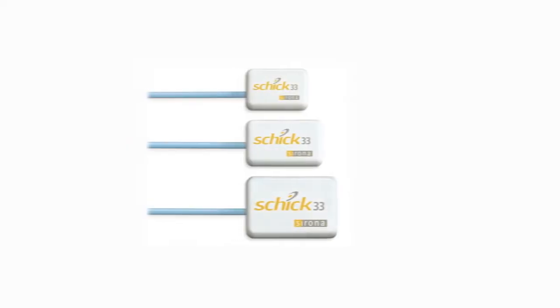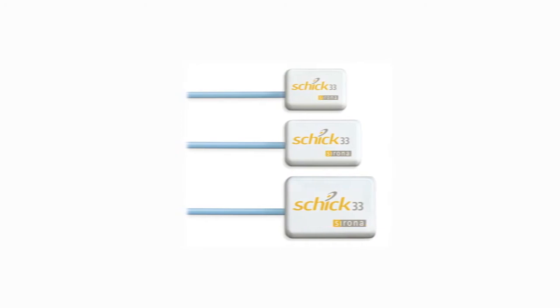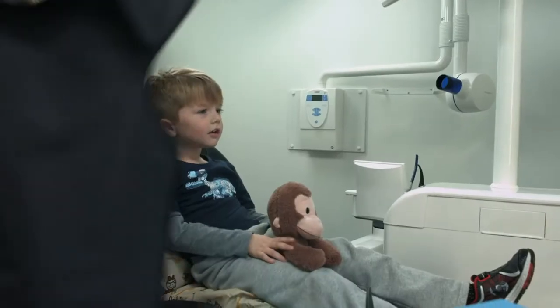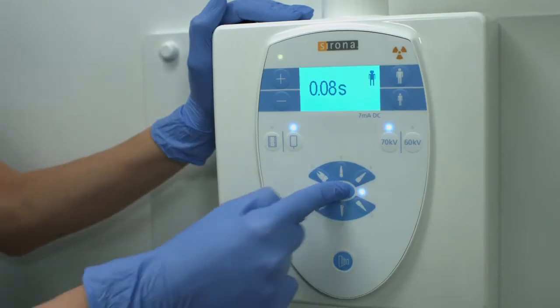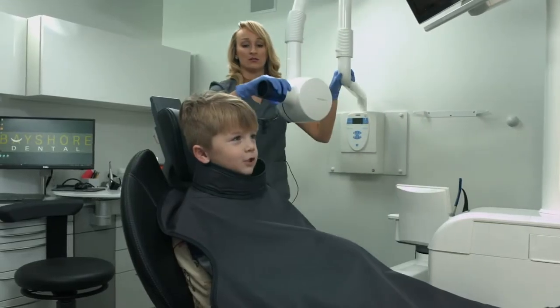Working with children can be challenging and it's really important that we have the right diagnostic tools to work with. Dentsply Sirona's size zero sensor allows me to work on the smallest of patients and I have the opportunity to increase in sensor size as the child increases in age. Our Heliodent Plus x-ray generator provides a pediatric setting to help ensure you provide a radiation dose that meets the ADA's as low as reasonably achievable guidelines.